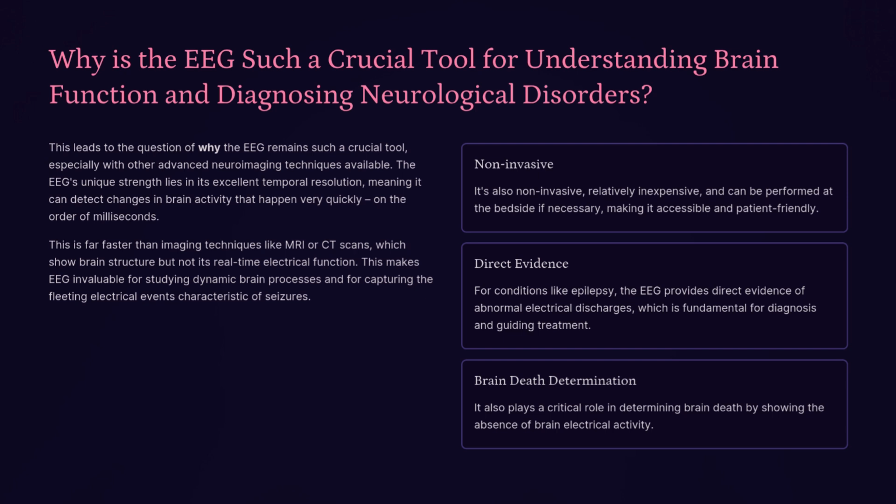This makes EEG invaluable for studying dynamic brain processes and for capturing the fleeting electrical events characteristic of seizures. It's also non-invasive, relatively inexpensive, and can be performed at the bedside if necessary, making it accessible and patient-friendly. For conditions like epilepsy, the EEG provides direct evidence of abnormal electrical discharges, which is fundamental for diagnosis and guiding treatment. It also plays a critical role in determining brain death by showing the absence of brain electrical activity.